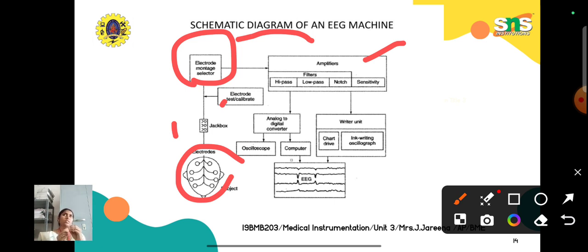A signal in that range is not easy to process with an electronic device. It is not in the acceptable range, so the electronic device will not accept it to go to the next stage to display it. Also, these biological signals, the inputs, everything, are taken from a live patient.